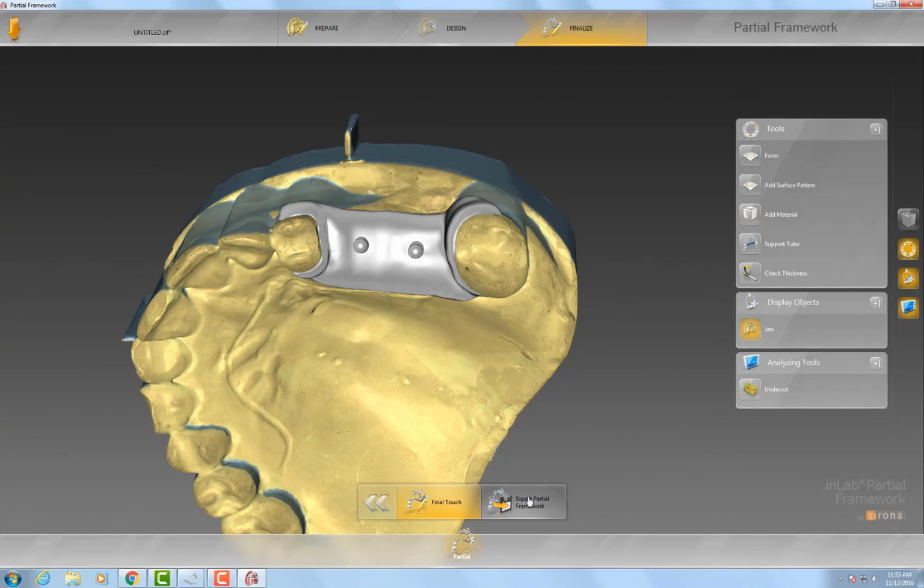Make this your laboratory. Take what I'm doing and implement it in your software, in your lab. I really want other labs to be the buzzword of your area, because when you're the buzzword, that keeps laboratories alive. It keeps the one man, the big man. It keeps all of us alive. And the reason I do this is not to keep a secret, but to improve the industry as a whole, which is this IPF software.